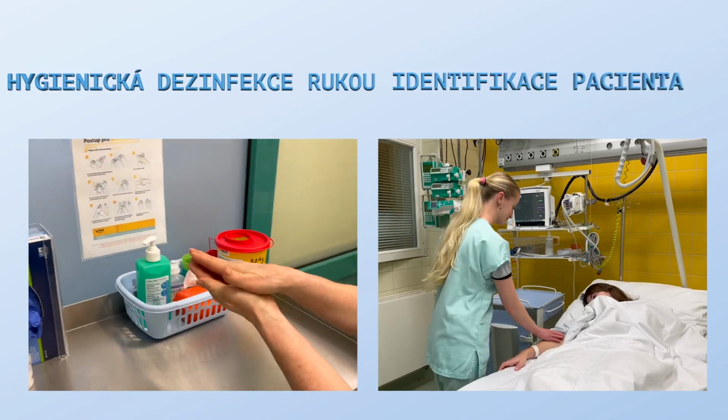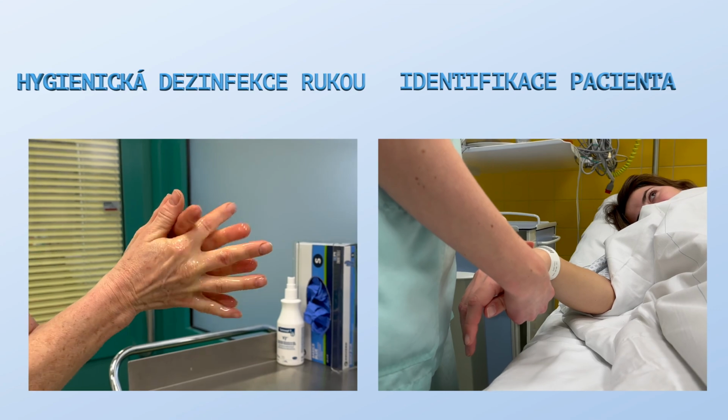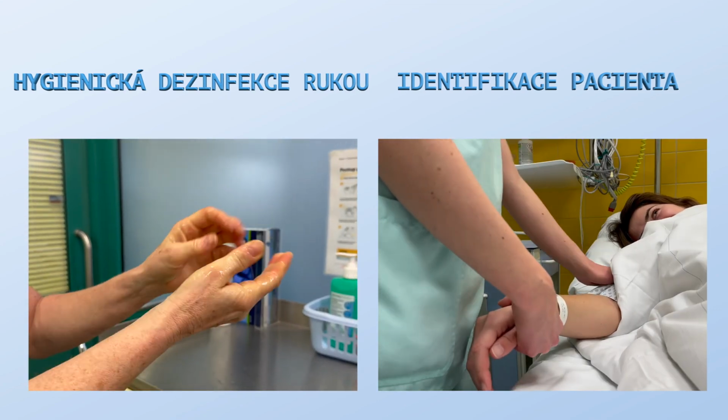Before inserting a short intravenous catheter, hand hygiene and disinfection should be performed, and patient identification should be verified by checking the identification label, including confirming the patient's name.